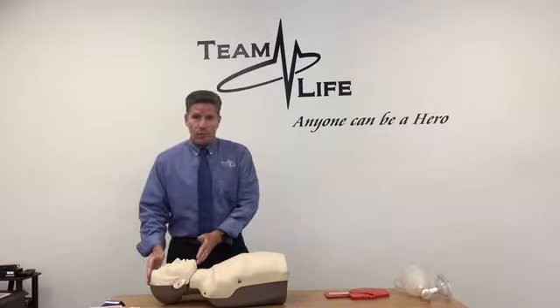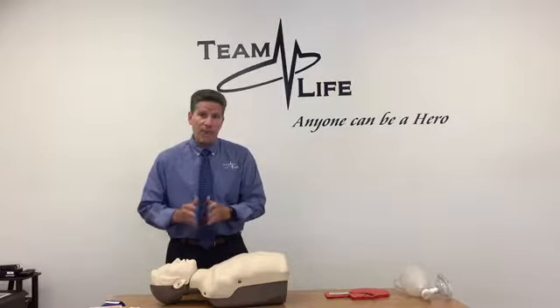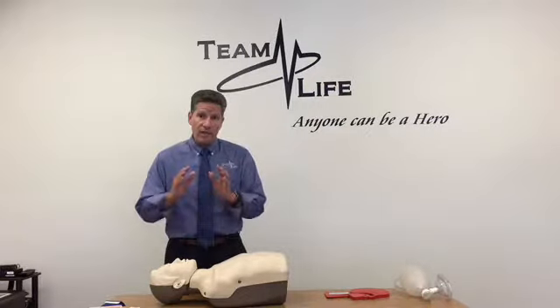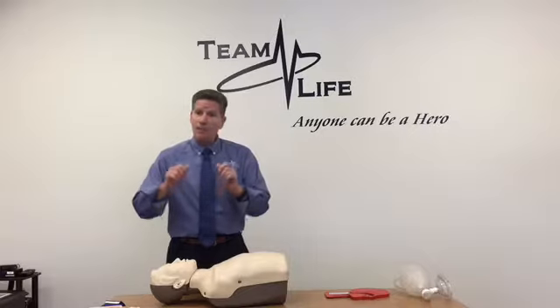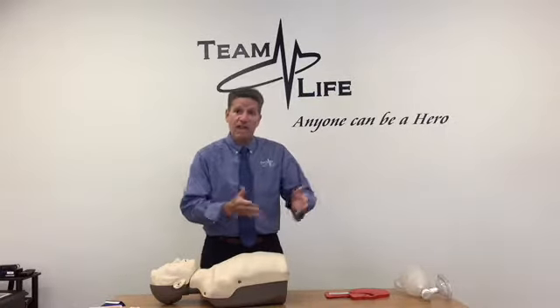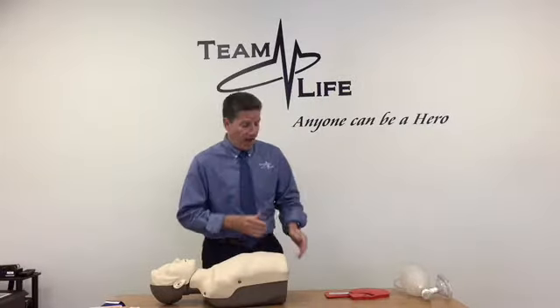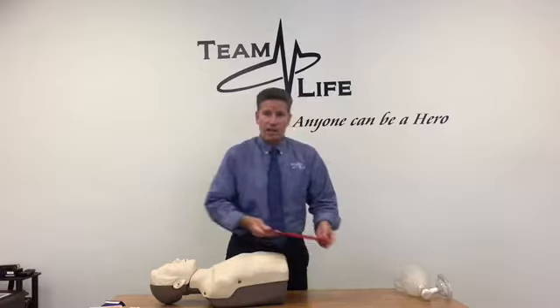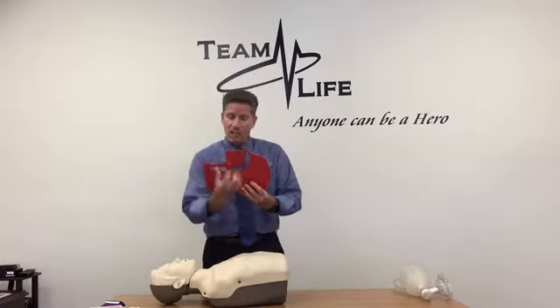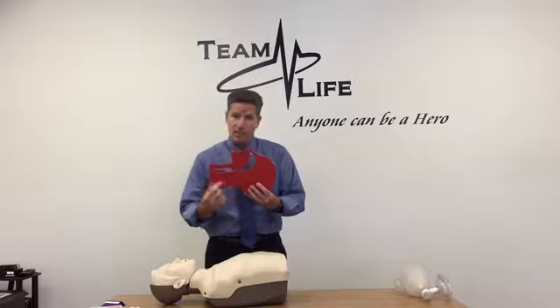One of the things we need to remember is what we're trying to accomplish. With the administration of intranasal Narcan, we're taking this medicine as we're squirting it into the patient's nose. We want it to get into the lungs and into the circulatory system, meaning I need an open pathway. If somebody is truly unconscious and flat on their back, everything's going to be pulled down gravity-wise. One of the things that's going to be pulled down is the patient's tongue.